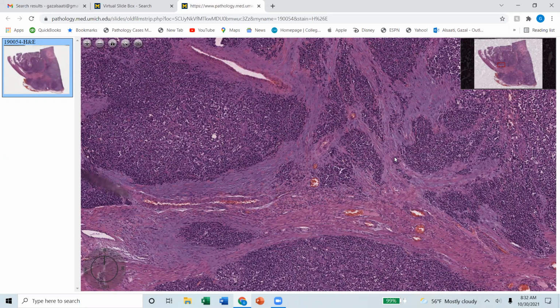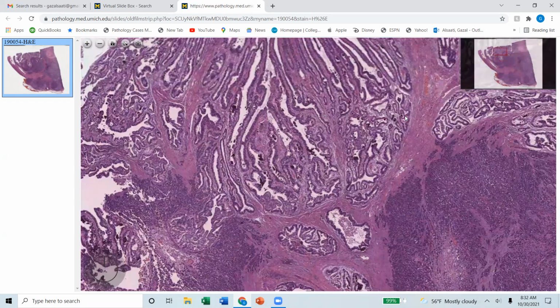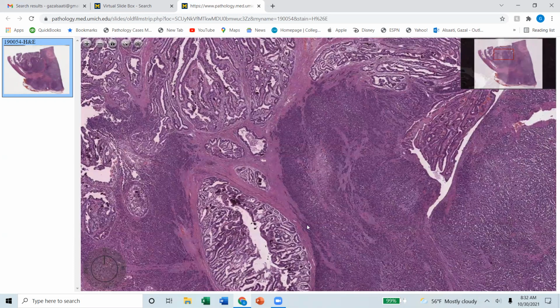She said, because based on morphology, this is adenocarcinoma. The patient has to be treated as adenocarcinoma. I don't want to confuse the oncologist and tell him there are neuroendocrine features. We're going to follow morphology and go back to our basics. So that was a very interesting case that morphology rules, even if the immunostain doesn't follow, because it looks like adeno. Of course they're calling this mixed because you have areas here that are going to be neuroendocrine, like synapto.